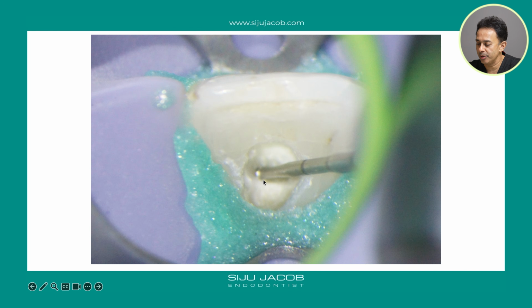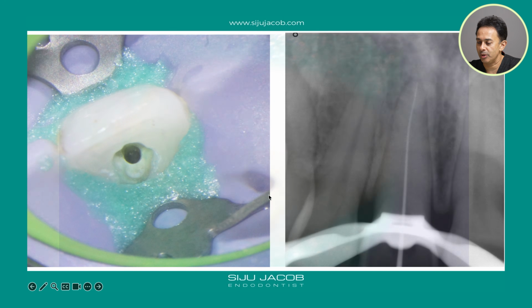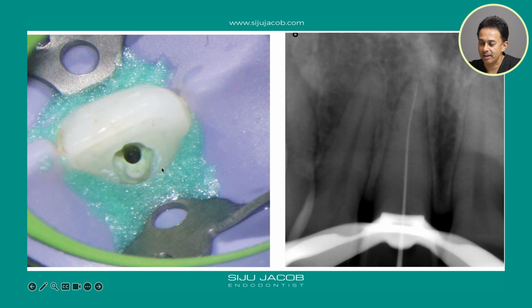We took a Munz burr, drilled down that part of the canal which was calcified, and sure enough, that's where we located the canal. You can see there's a canal there, and that's a K file inserted in the canal. So that's an example of how we use color changes as a clue to locate the calcified portion of the canal. Remember that in order to do this predictably, you need a microscope. If you are using loupes, then remember that as you go deeper into the tooth, loupes do not have coaxial illumination, so it gets a lot more difficult to do this without a surgical microscope.